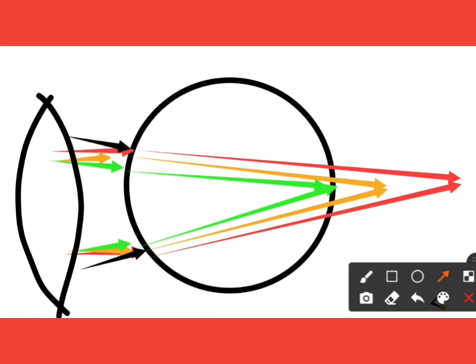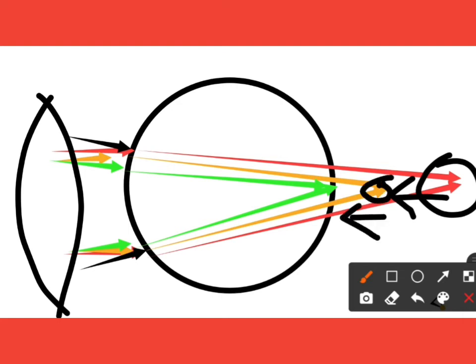It means that this red will come a little forward, so yellow will also go a little forward and be focused here, and green will focus here, so that the patient will say that both red and green backgrounds appear clear. This is how it is done.